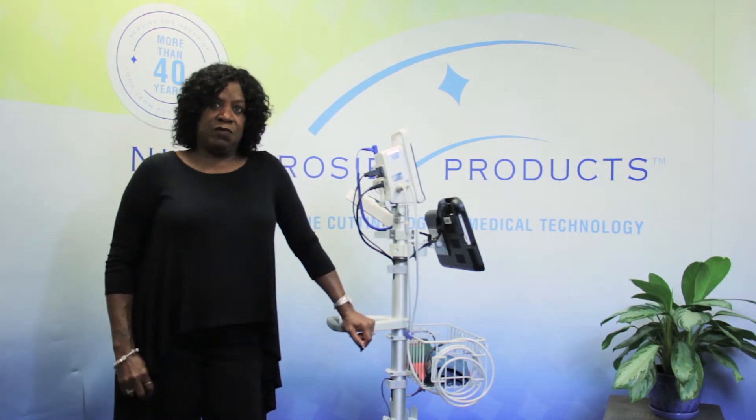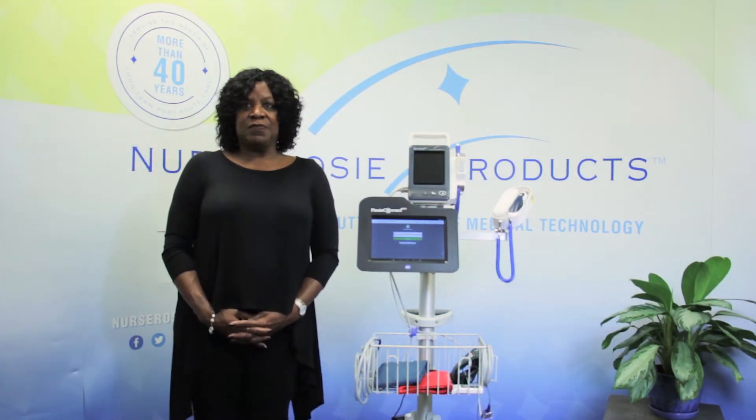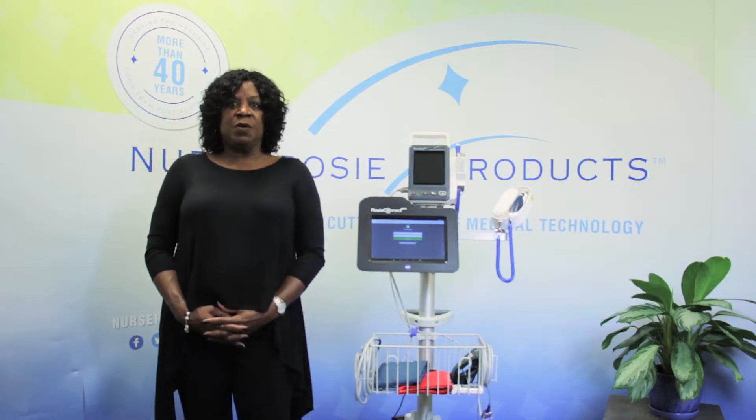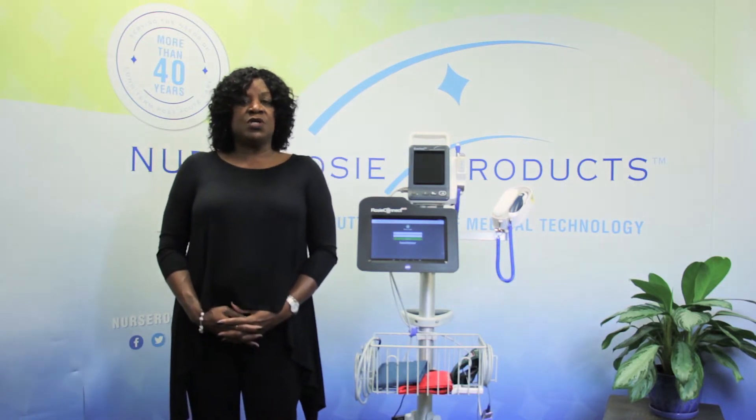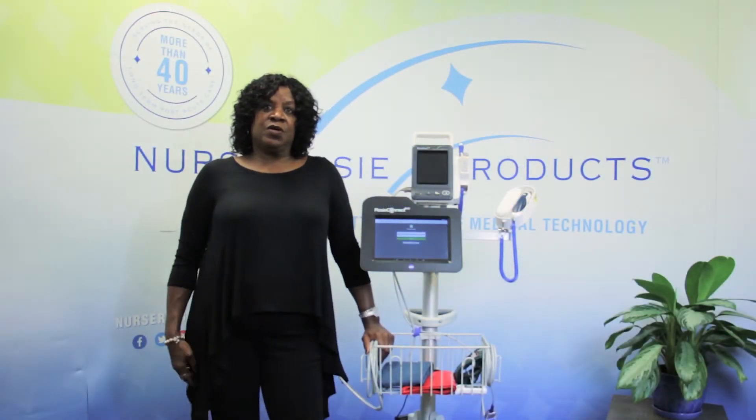Please stay tuned to the end of the video for some other important troubleshooting tips and tricks. Remember, if at any time you need to pause the video to practice, please do so. Every small step that we take with the training is important for the next step. Whenever you first turn on the vital signs monitor and the tablet, they will go through a few steps to initialize and then you will see the login screen.